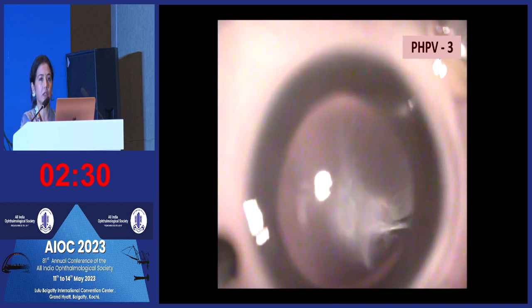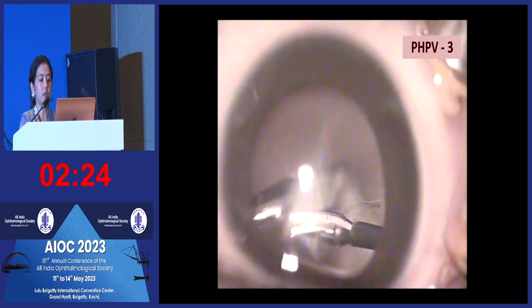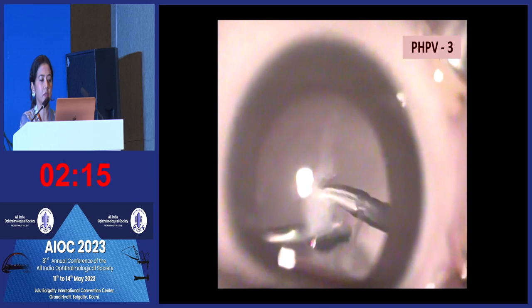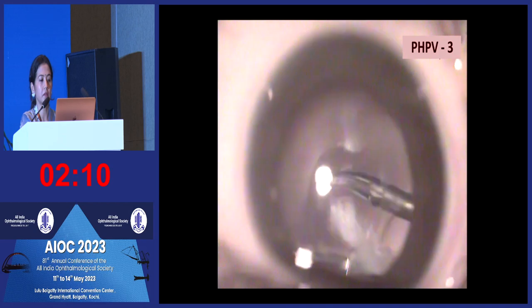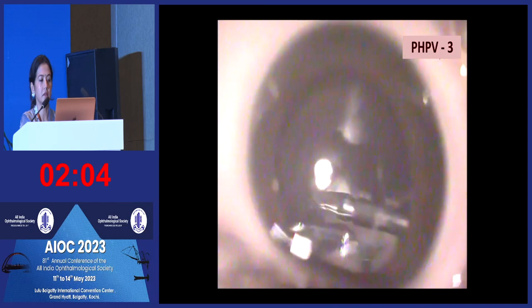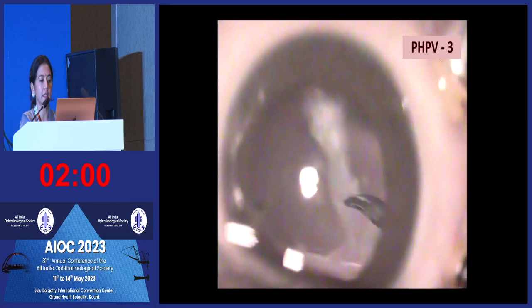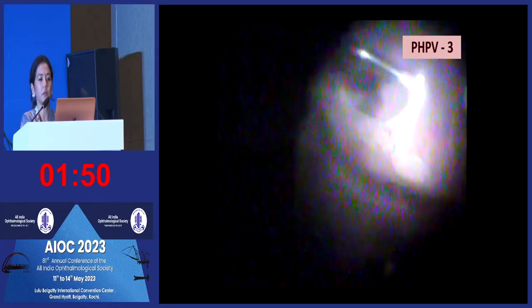These can be vascular sometimes, and you have to ensure that you do a cautery. Otherwise, it could just bleed into the eye and make you lose your plane of treatment. So here, as you pull with the forceps, you pull the tag posteriorly. You snip it with your scissors, and then using your cutter you can just trim the tag and then come back and do a complete vitrectomy.